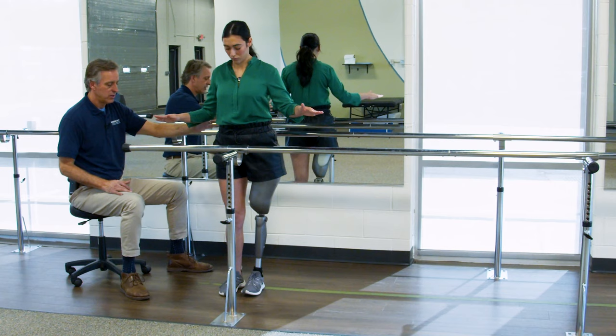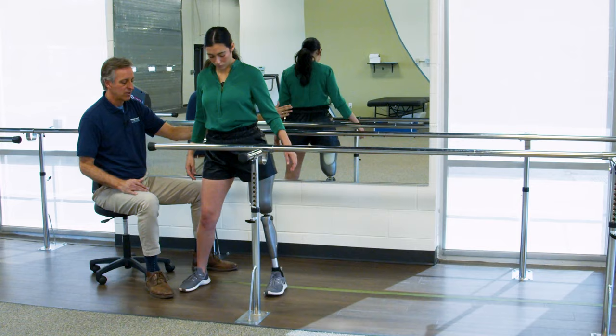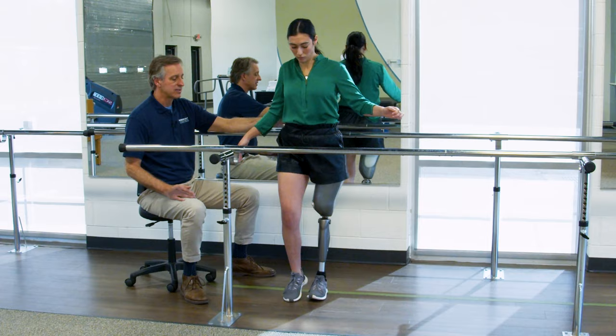Excellent, and the same thing going back. You're going to go back, shift over, up and hold. Now you're going to find it's a little harder to do holding that balance going back because she has to really kind of throw her weight over the prosthetic device.